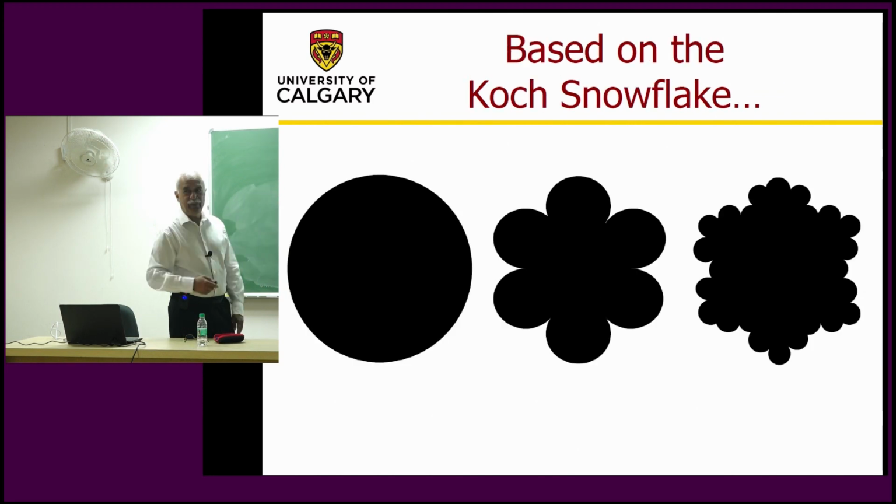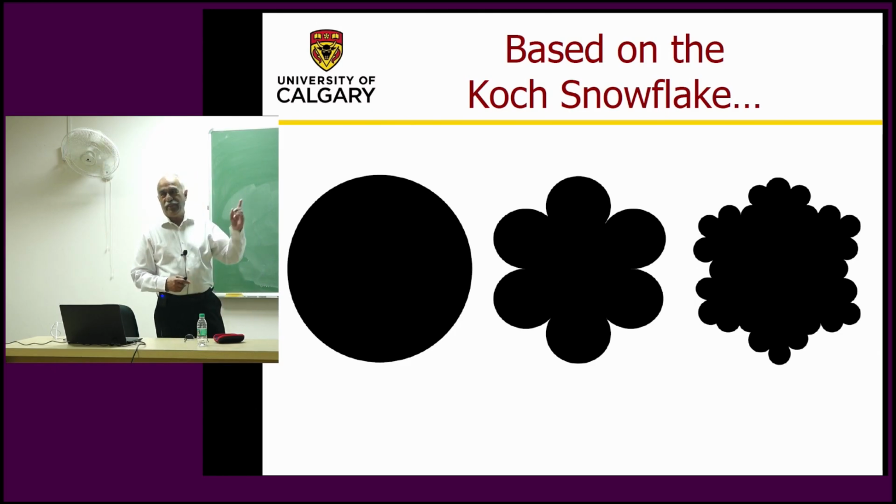So I said, well, let me do that with circles. That's done with triangles. So what about macrolobulated versus microlobulated masses? So start with a circle and break that into thirds and draw circles. These are all circles, but the inside is blocked out. They're all black circles, so they overlap here. So I'm interested only in the contour. So no lobules. Now there are 6 lobules. I wanted to do 3, but I don't know why I didn't put it.